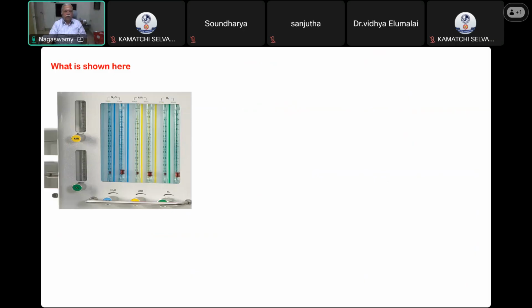This is slightly different from the older twin tube flow meters which you saw here earlier. Yes, sir. Here also you have the 2 flow tubes, one for low flow and another for normal flow. Is there any color coding? The color coding is there. First is nitrous oxide, last is oxygen.